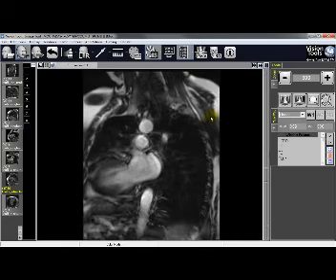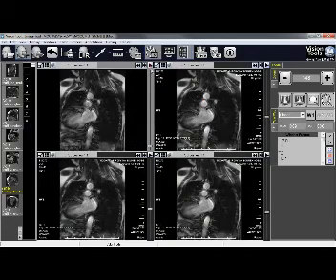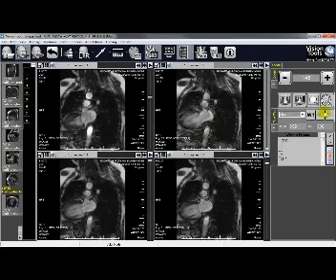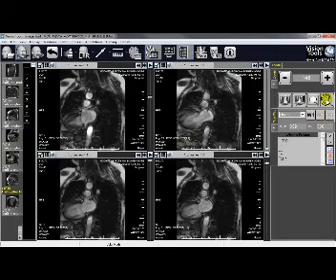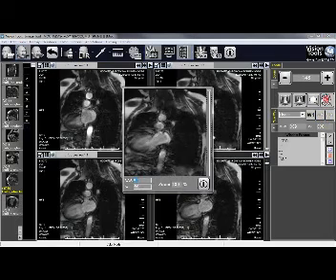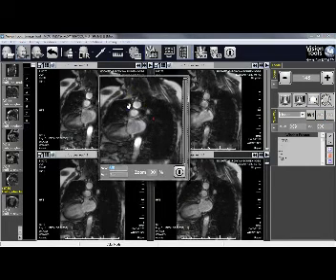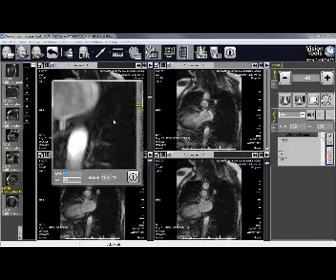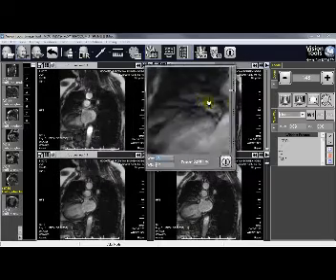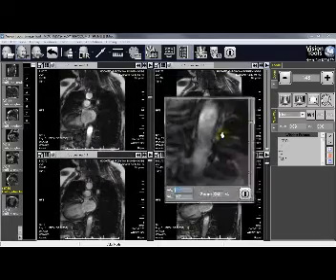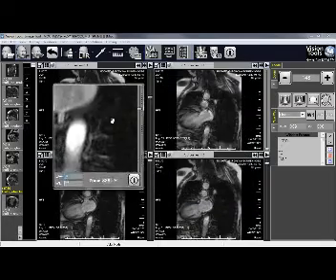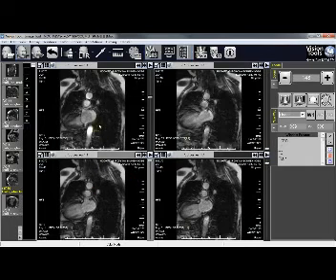Another feature is the Cine mode — just double-click to run the cine. There is also a magnifier tool: you can get a magnifier glass, which is especially effective for X-ray and mammography studies.